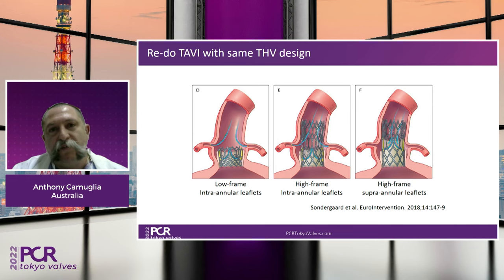In the last couple of weeks, a publication came out in the United States. Half of people getting an aortic valve replacement under the age of 65, so someone under the age of 65 in the US getting an aortic valve replacement, half of them are now getting TAVI for various reasons. So this is happening all over the world. Then we need to think about coronary access.